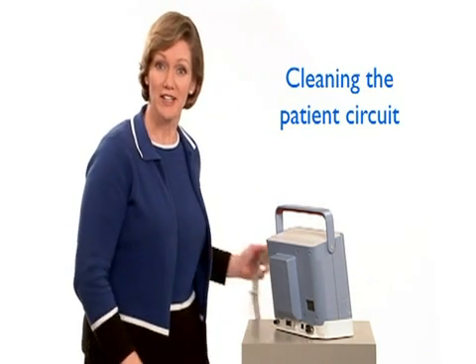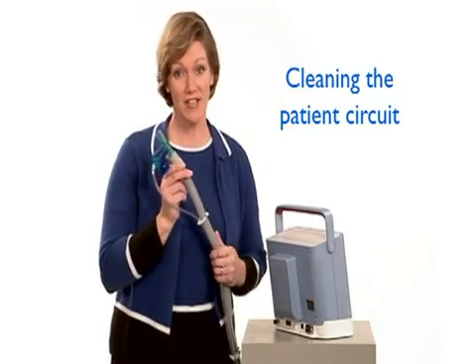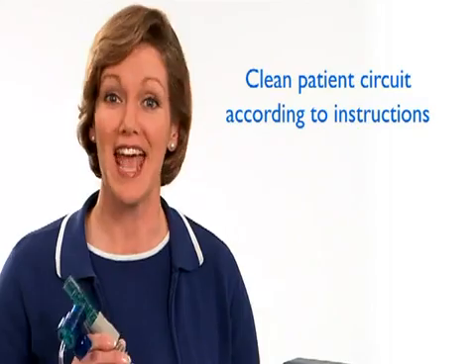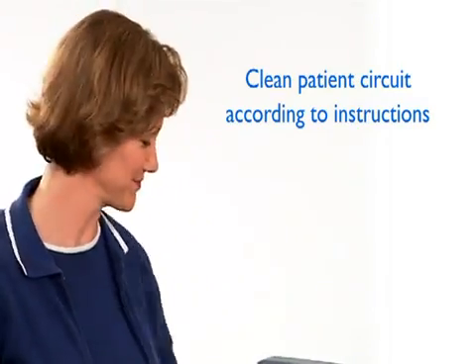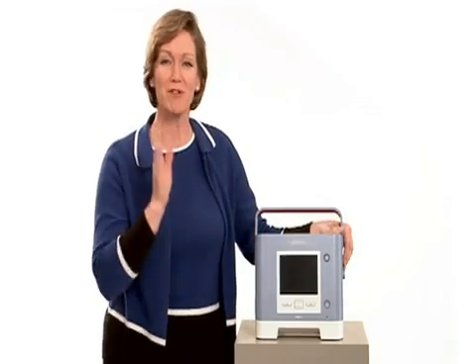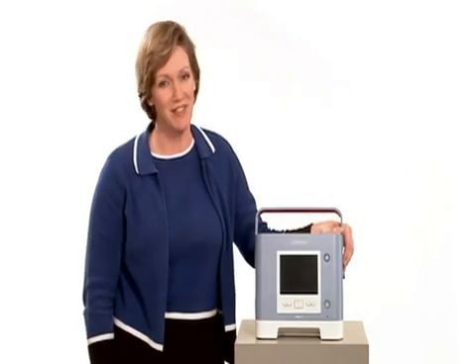To prevent infection, cleaning the ventilator circuit is essential. Follow the home care provider's instructions on how to clean the circuit and how often it should be done. With proper care and maintenance, your Trilogy100 can provide safe, reliable ventilation in the home setting.